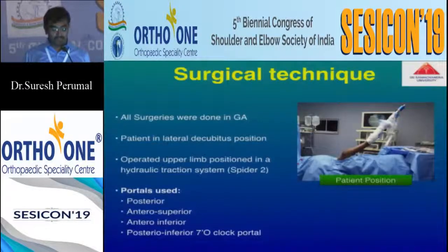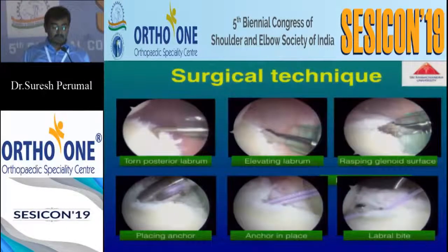It was a standard surgical procedure done under general anesthesia, with the patient in the lateral decubitus position, in a hydraulic spider traction system. The portals used were the posterior, anterosuperior, anteroinferior, and the posterior inferior portal, that's the 7 o'clock portal. The torn posterior labrum is identified and elevated, and rasping of the glenoid surface is done. A single loaded anchor is placed, and the labral bite is taken.